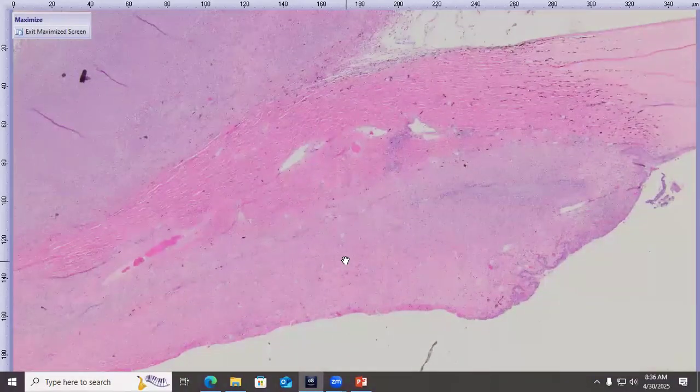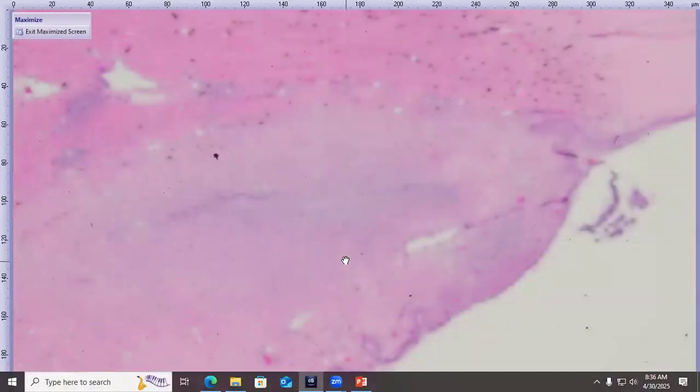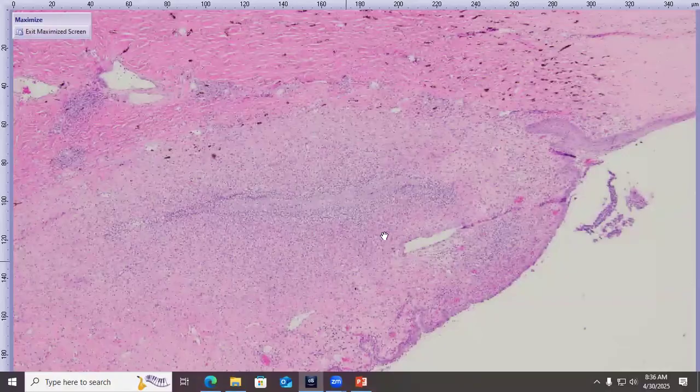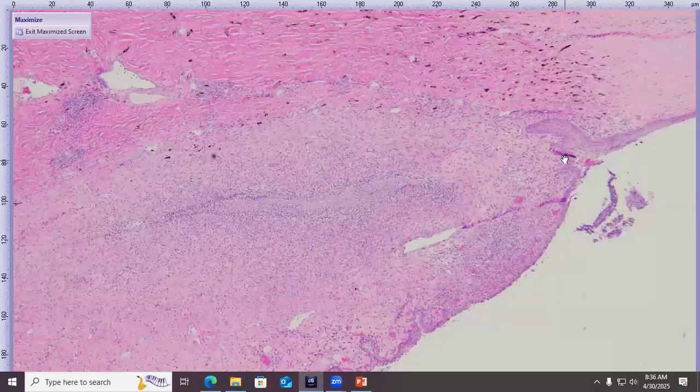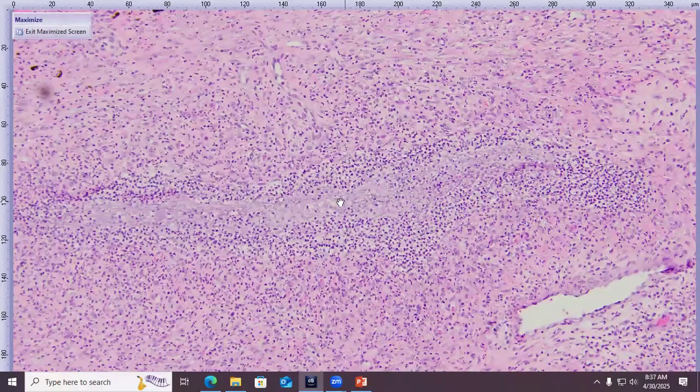And then before we move on from this case, let's take a look at that suspicious area of conjunctiva. So the conjunctival epithelium is fused on itself ever so slightly right at the fornix, which is what we refer to as peripheral symblepharon, which could, in this case, just be a consequence of local inflammation. And then this is actually this narrow linear area of cavitation filled with neutrophils. And then we have maybe a little bit of a fibrovascular reaction in the surrounding conjunctival substantia propria.